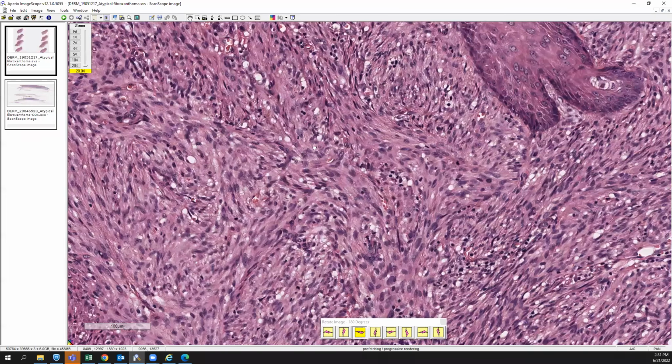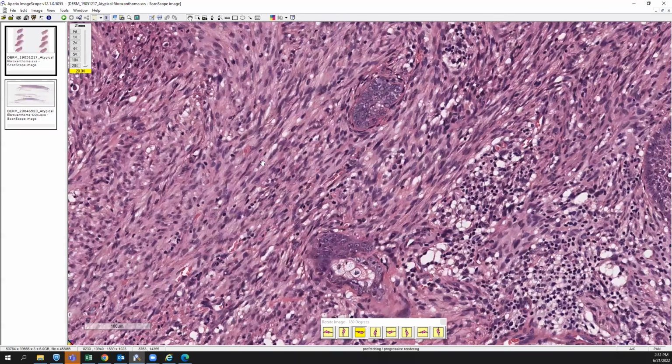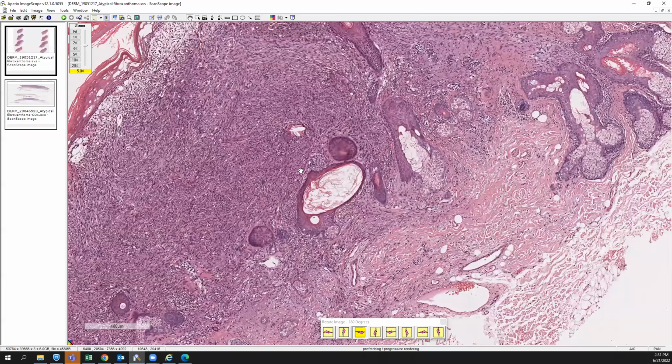And so you need to understand that there's a workup involved. And if you get a digital slide like this, they would probably just tell you it's negative for all of those other markers, and then you would be able to choose atypical fibroxanthoma. And remember, if it goes down deep into the subQ and you see invasion and necrosis, you can think about pleomorphic dermal sarcoma.